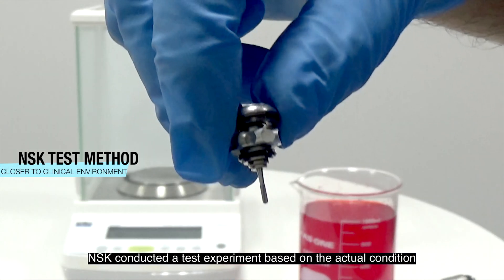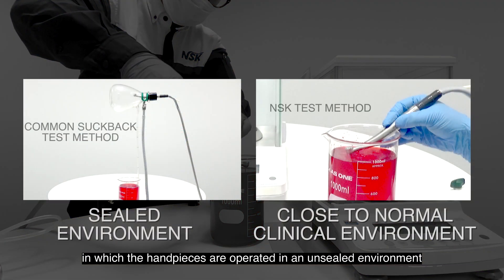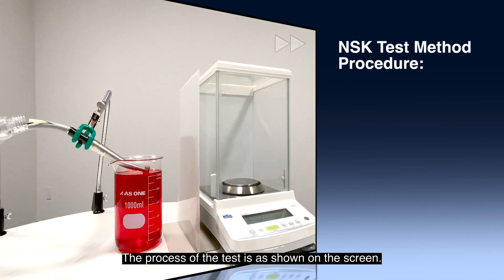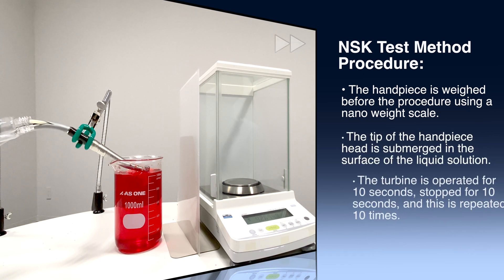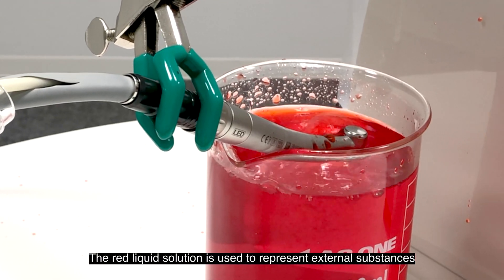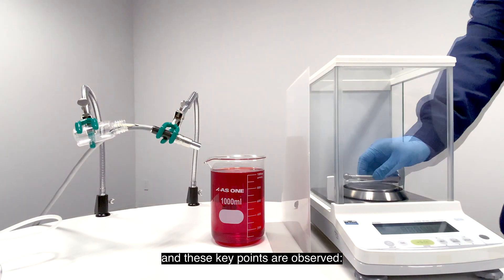NSK conducted a test experiment based on the actual condition in which the handpieces are operated — where the head physically touches the extraneous substances. The process of the test is as shown on the screen. The red liquid solution is used to represent external substances the handpiece may be exposed to, and these key points are observed.